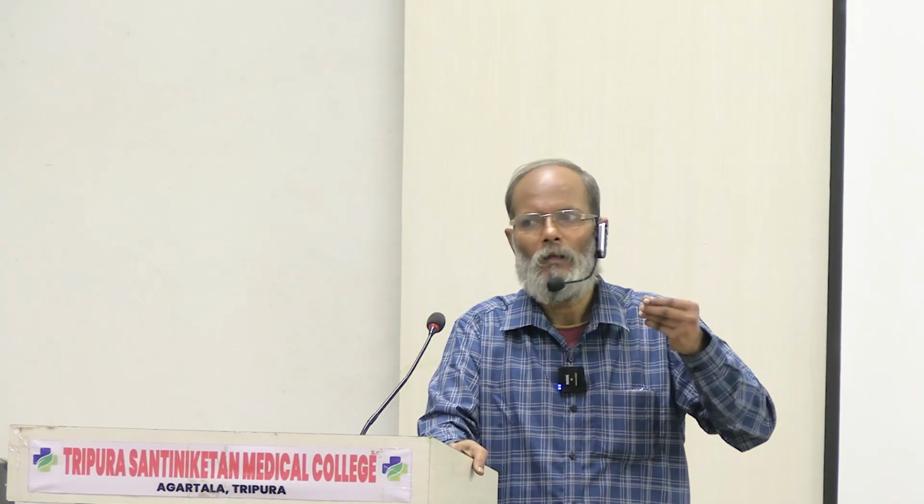So, what is needed? We need to do first a plain X-ray. We take the size, shape and location of the organ and see whether there is any abnormality within the organ or in the system, that is pyloric obstruction, hyperthyroidism, diarrhea, that obstructs the entry of dye within the kidney.